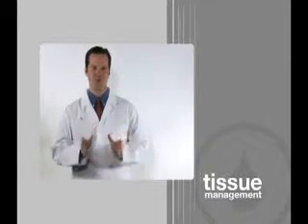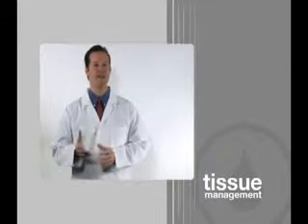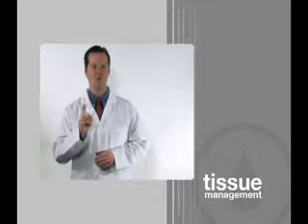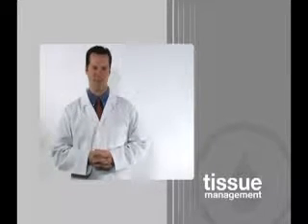Dentistry has changed dramatically in the last few decades and continues to change daily. The instruments, materials, procedures, and techniques we use are constantly evolving. But one thing will always remain constant: the critical importance of predictable tissue management.